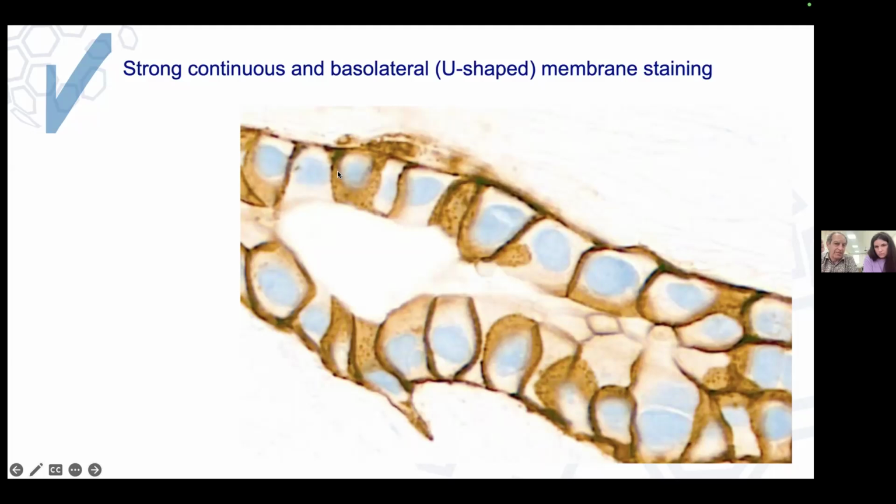Some of them may be truncated, some of them may stay in the cytoplasm. We know very little about the life of the molecules produced by these amplified genes. And also, if you are producing such bucket loads of protein, some of them will stay in the cytoplasm because that's where they are made and assembled. So it's possible that some stay in the cytoplasm.